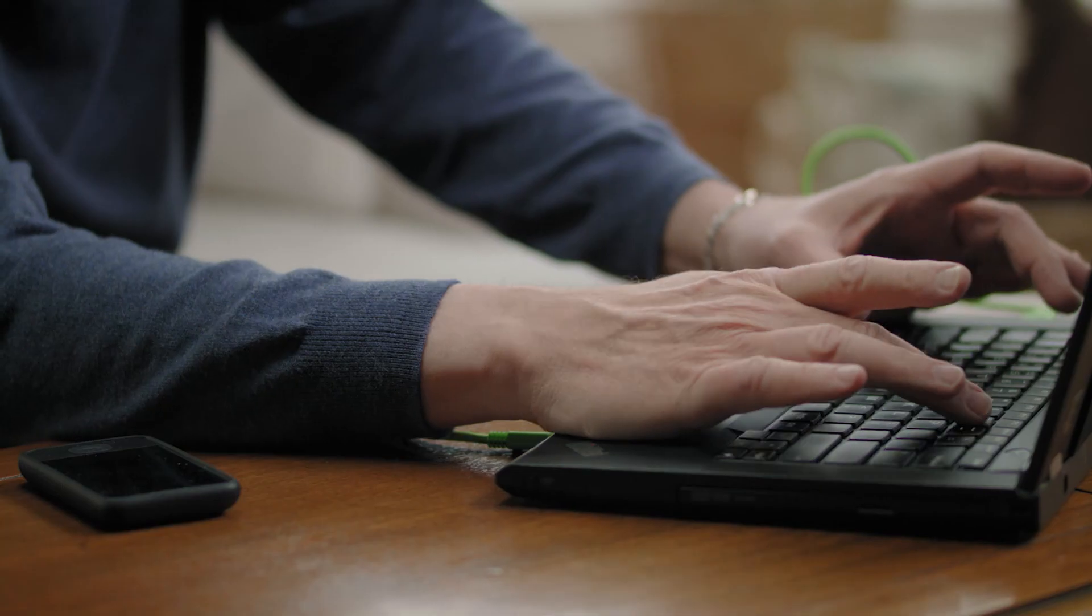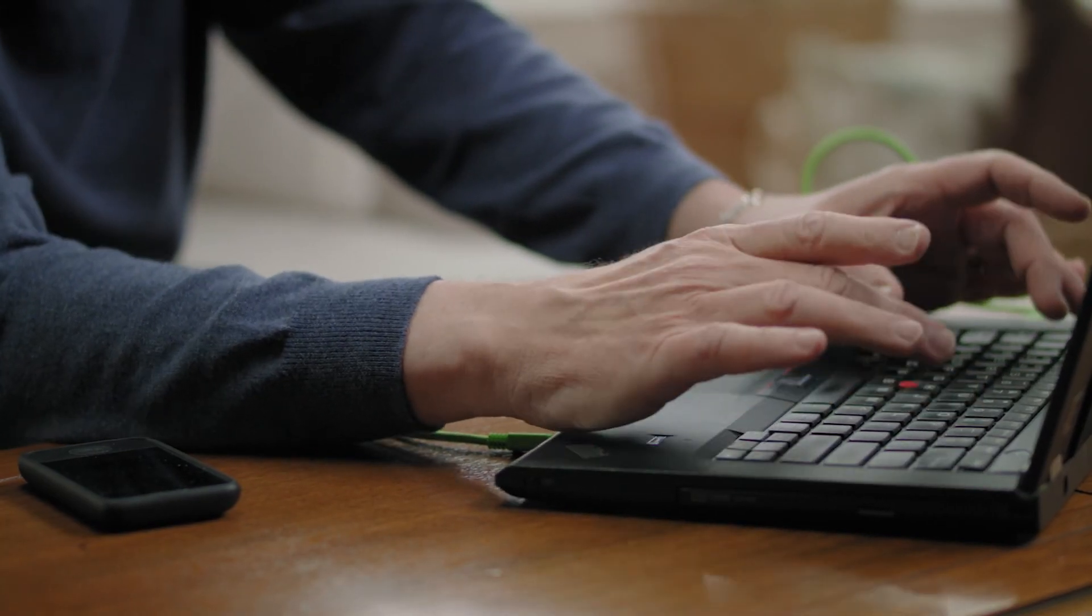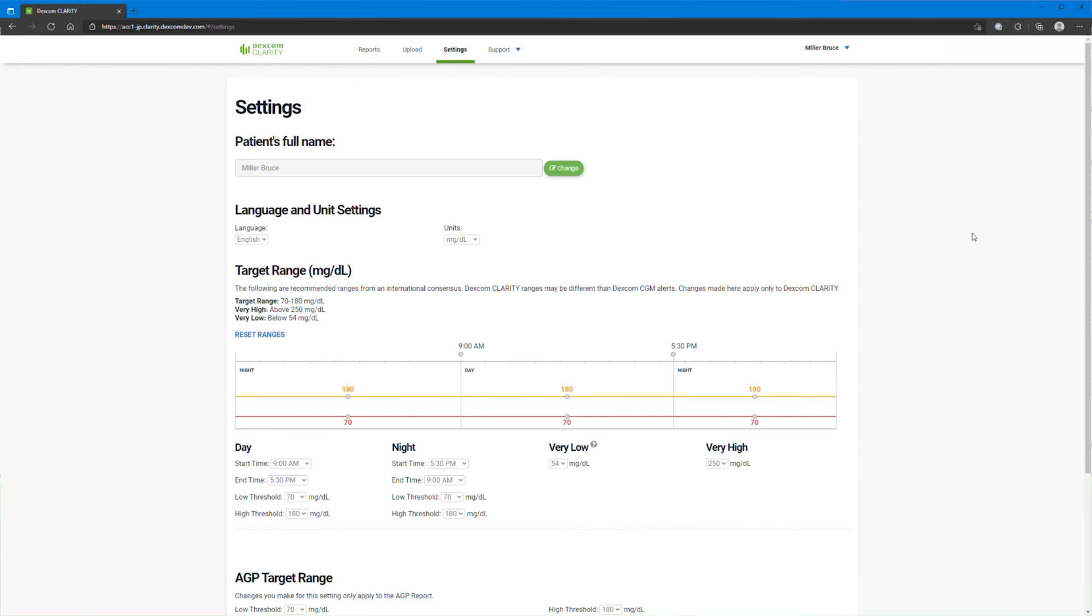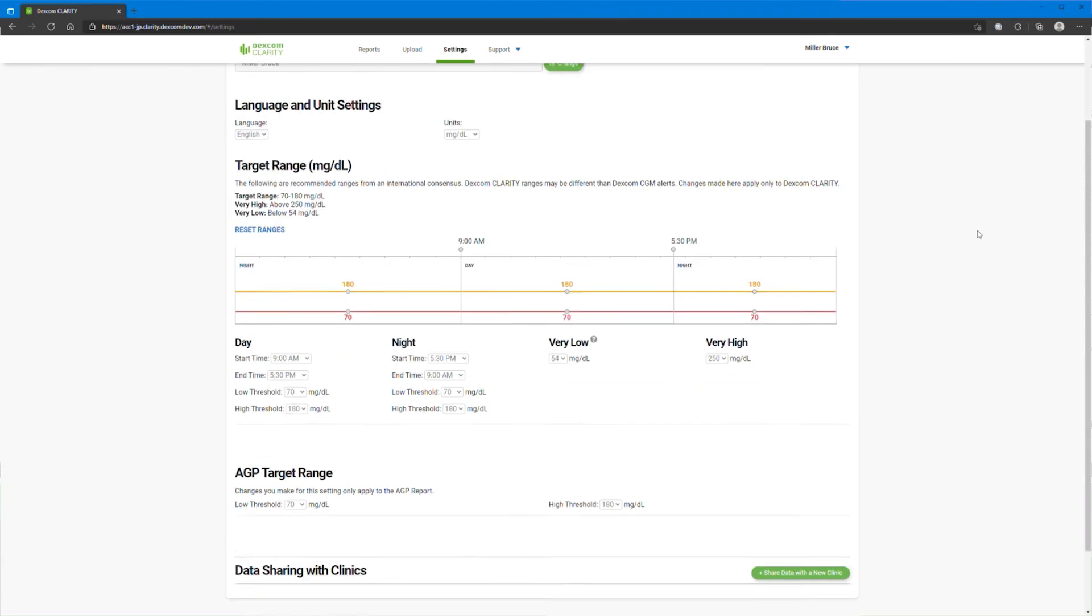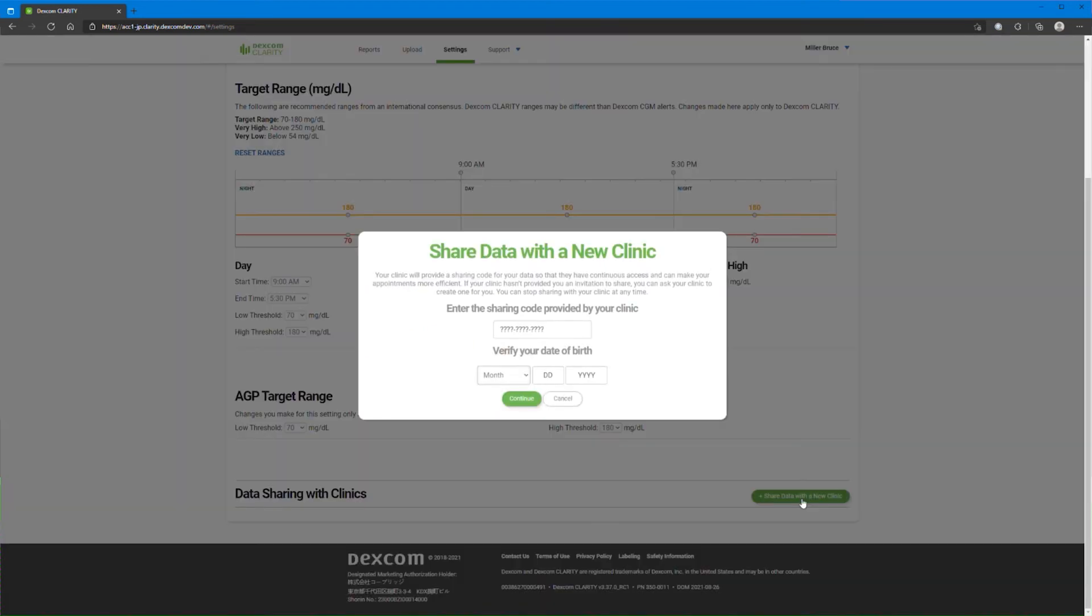You can share your Clarity data with your clinic so they can see your data during visits or anytime you might need assistance. Click Settings to accept a sharing code from your clinic. Scroll down and click Share Data with a New Clinic to enter the code. Follow the on-screen instructions.